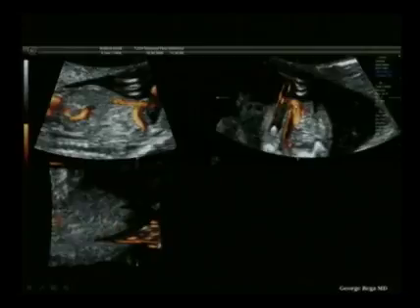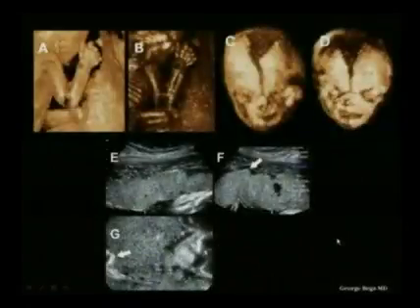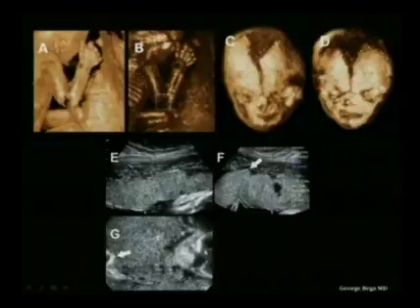This is a power Doppler acquired slowly for 5 seconds, and as you can see in B and C, you may not see them in the acquisition plane. You may see this movement, these motion artifacts. They have to be known because they may be problematic. This is a rendering artifact, and this is basically a surface rendering. This is a maximum intensity projection to look at the bony structures, but the threshold is a tool that removes low intensity echoes. Here it has been a little bit exaggerated.